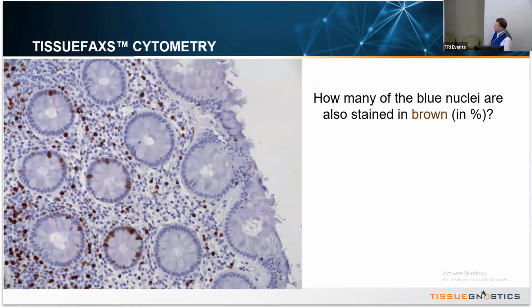Also, when we look now at a specific microscopic image, an immunohistochemical staining of colon with a well-known marker, the peroxidase DAB staining system, the marker is Ki67, a proliferation marker expressed in the nuclei of cells. Then I have another question for you.